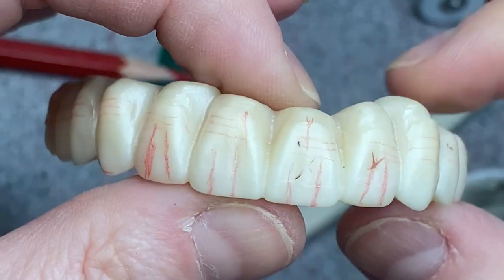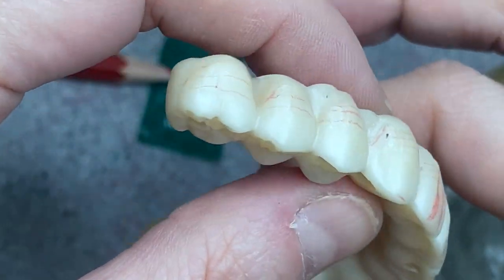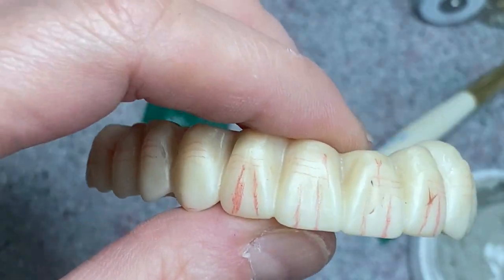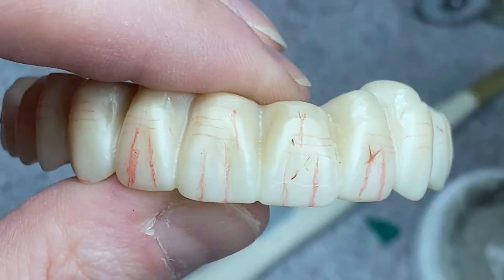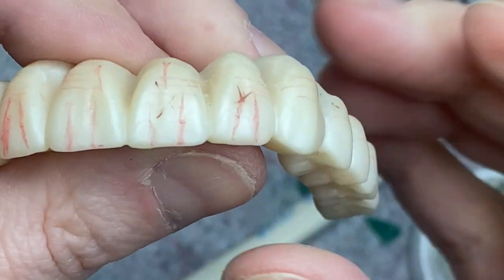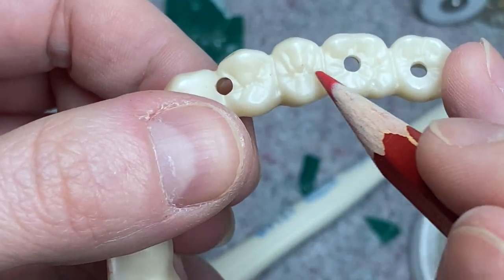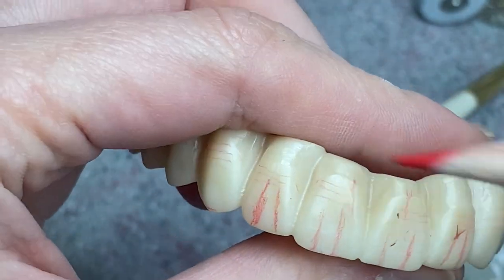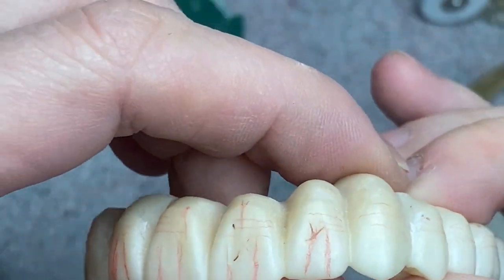Hi guys, in today's video I'm gonna show you how I do this kind of case — it's a hybrid case, full contour zirconia with tissue. I did draw how exactly I'm gonna make the anatomy on them, so all these lines are the anatomy. Then I'm gonna show you how I accentuate the anatomy, and finally we're gonna layer all the tissue on this case. All right, let's go.